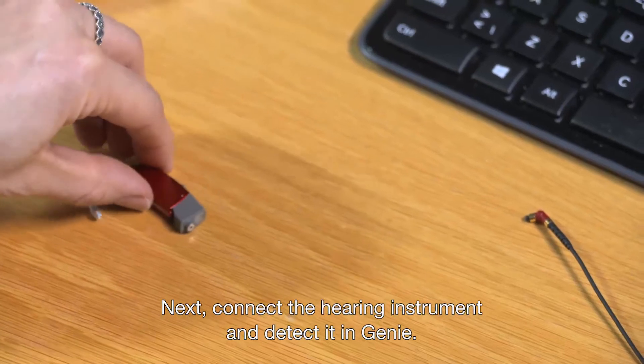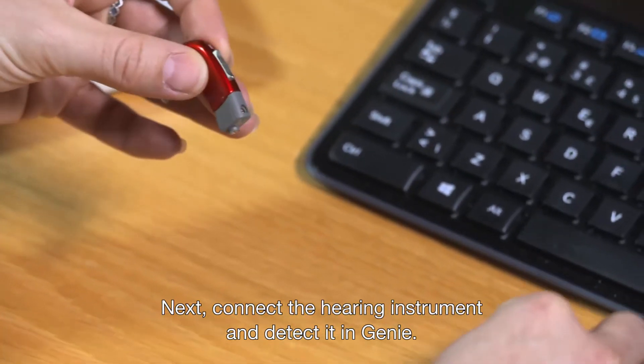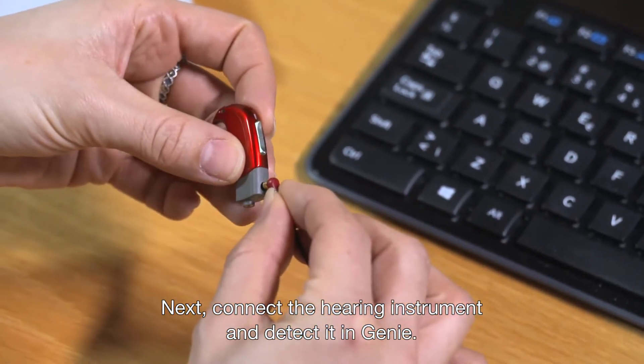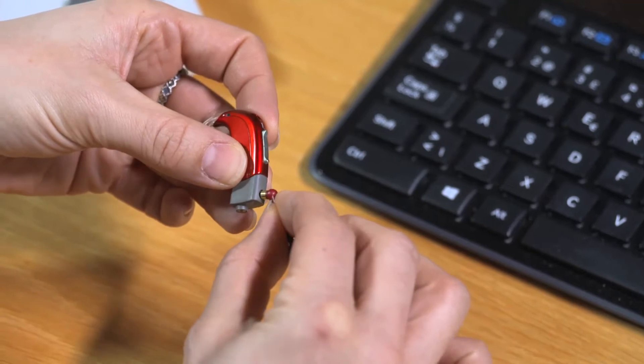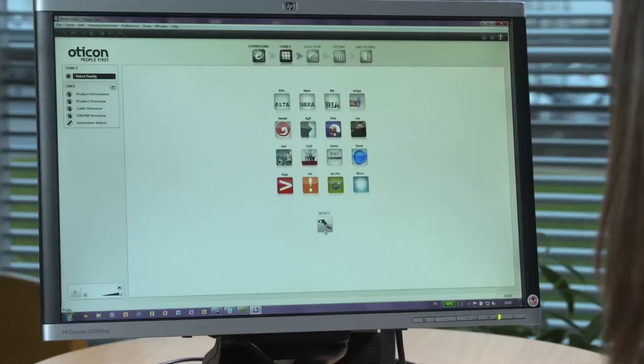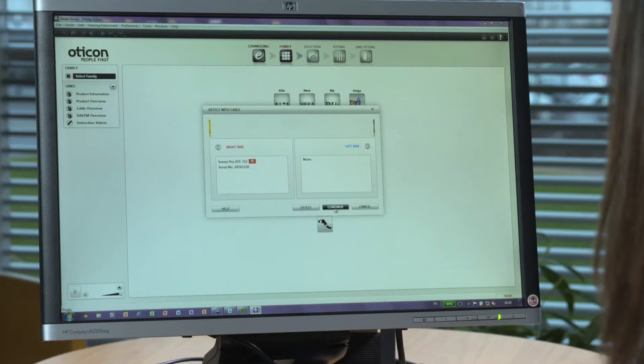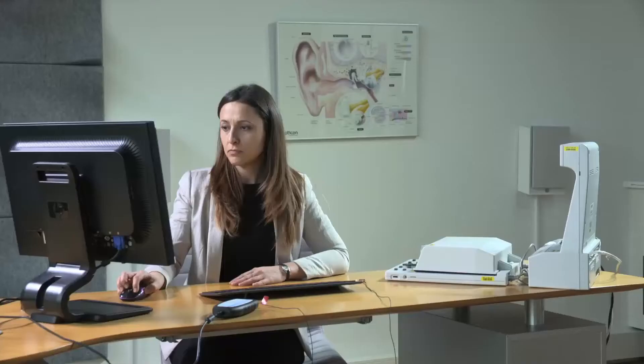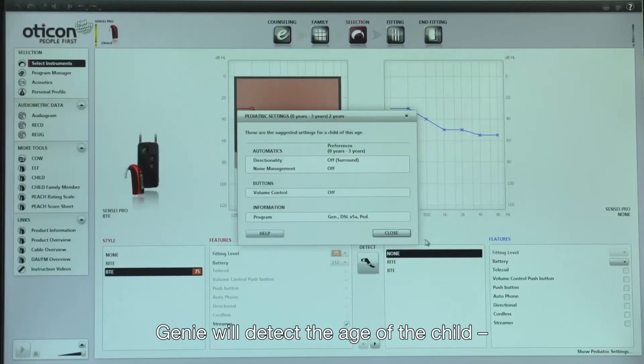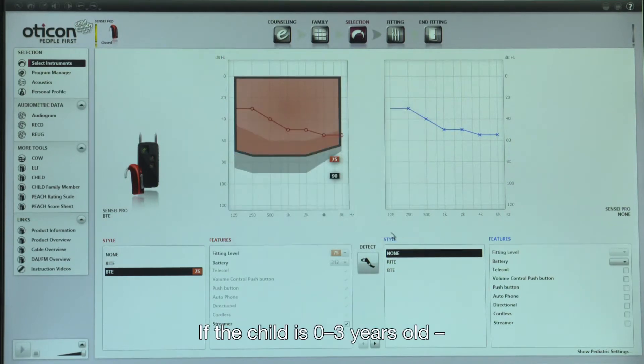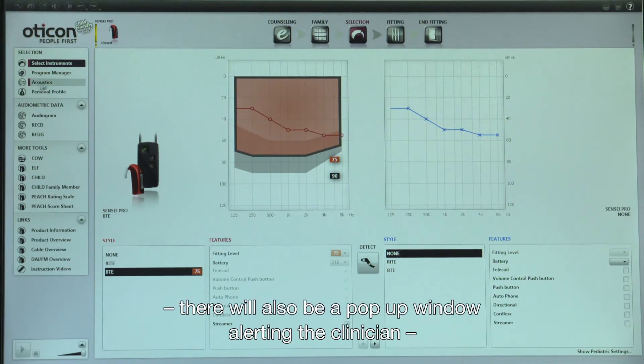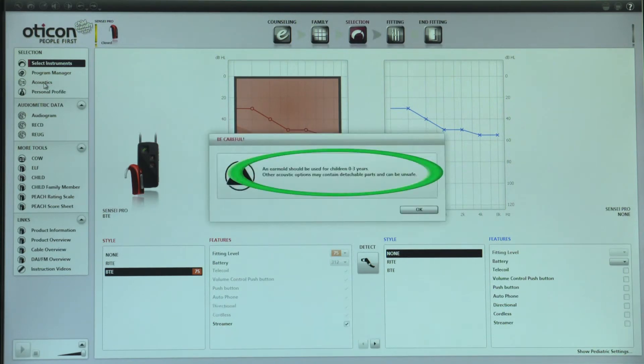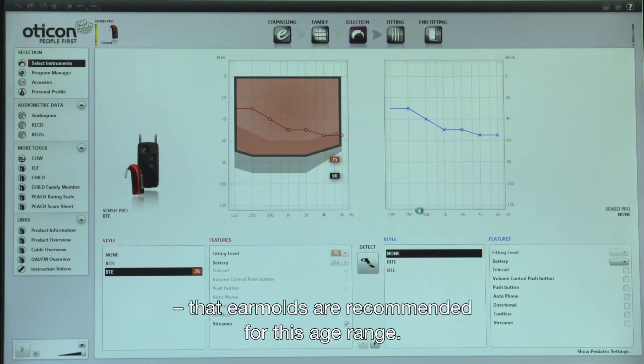Next, connect the hearing instrument and detect it in Genie. Genie will detect the age of the child and display the default pediatric settings for that age range. If the child is 0 to 3 years old, there will also be a pop-up window alerting the clinician that ear molds are recommended for this age range.